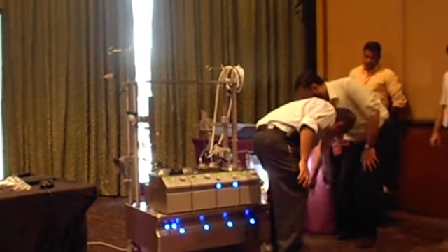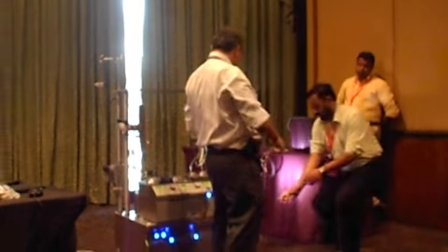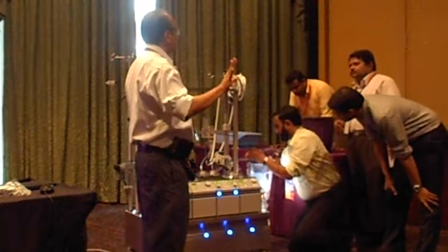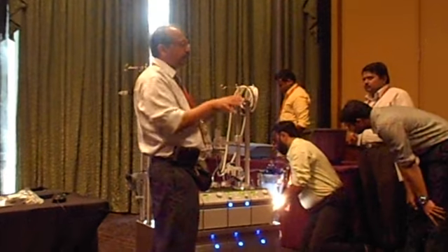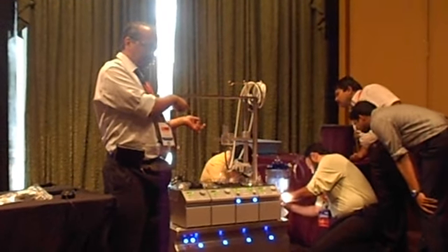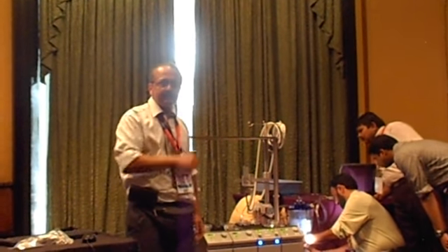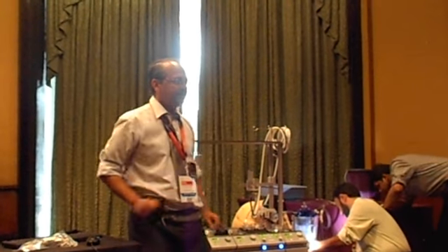Remember, all of these can be detached. The reservoir and the oxygenator are not one unit. Even the Terumo can be separated. Every oxygenator is designed this way, and there is no oxygenator where it is fused together, for this reason: you have an option to change the reservoir, and you have an option to change the oxygenator unit. This has to be practiced. Perfusionists have to practice it. In the perfusion exam, we actually ask them to change an oxygenator within minutes.